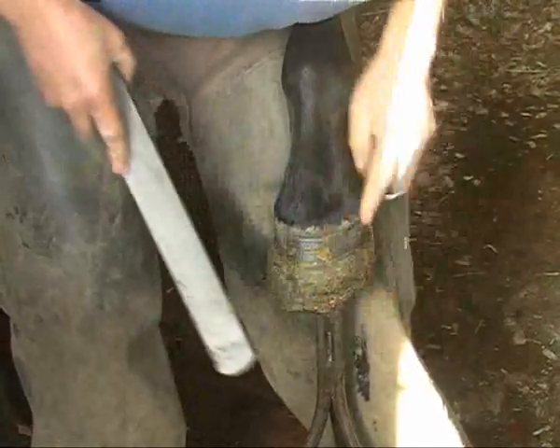We'll take this back so it's straight down with the wall here. You can see the white zone just here — completely isolated, not producing any white horn at all. There's no unification between the bottom edge of the dorsal wall and the solar plate. We're now just picking up a little bit of the wall above the dorsal depression. The depression is caused by the separation, and we're back nearly as far as we want to go.